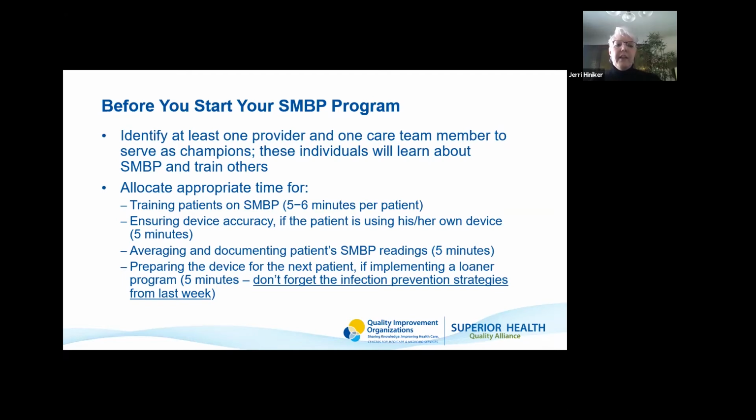Also, make sure that you're allocating appropriate time for things such as training patients for SMBP. Usually it's going to take 5 to 6 minutes at least per patient on training them on the SMBP program and using the cuff. Make sure, again, that you have time in place to ensure device accuracy, especially if the patient is using his or her own device. So that usually takes about 5 minutes.